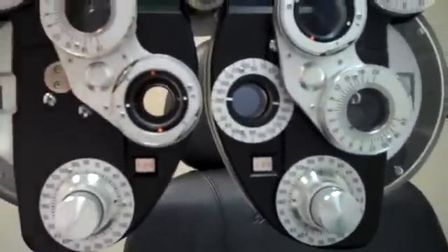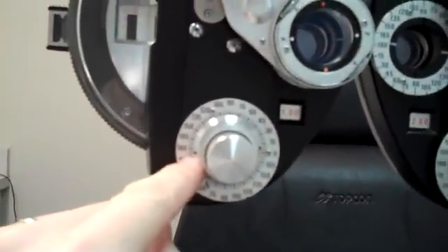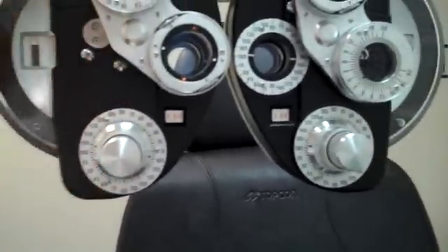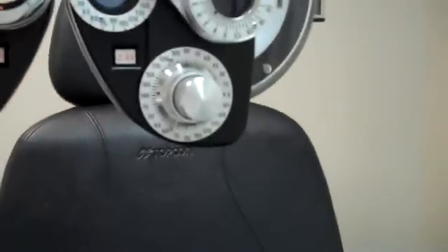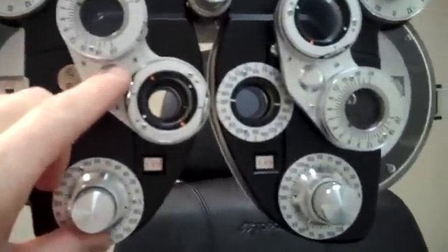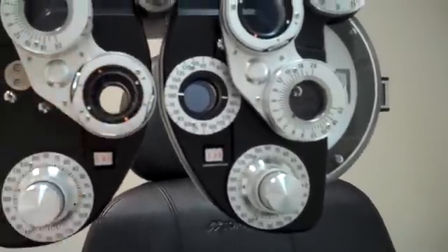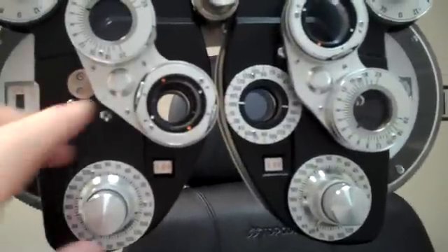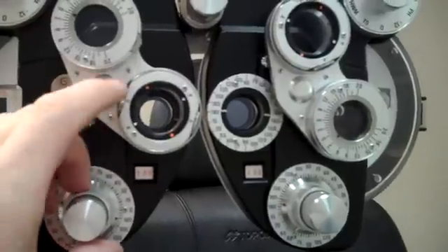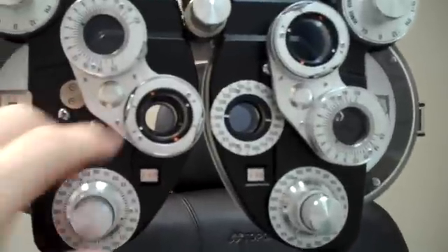I want to know the angle exactly — is it 5 degrees, 15 degrees, or 167 degrees? So what I do is put this little lens in here. There are four little dots, two red and two white, and I'm going to flip this back and forth. Does this look better or does this look better? Number one or number two — you'll hear it asked in all kinds of different ways.